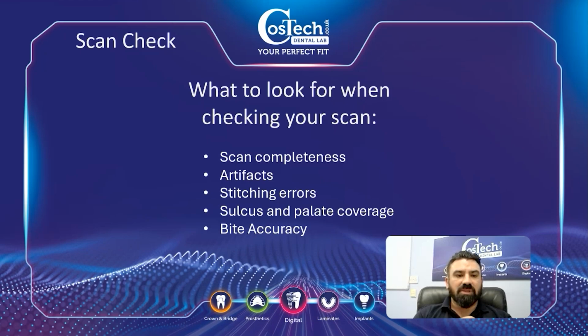Tricks that various people I know use are thick lollipop sticks, a mirror as well, just to hold the tissue as you're scanning, keeping the cheek retracted. So just have a look for artifacts. Chairside, with all the systems, you can usually highlight it and delete it. If it's accidentally attached the artifact to the patient's dentition or the soft tissue, you might have to delete it and rescan just that area.